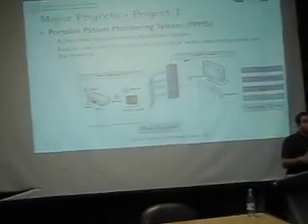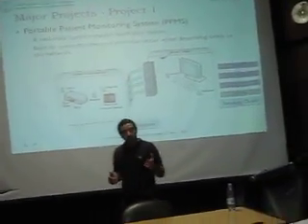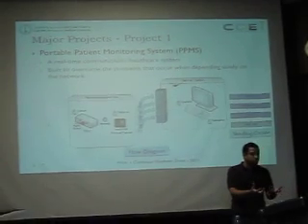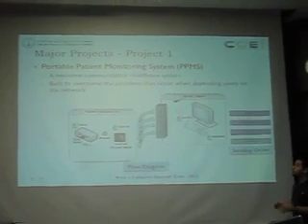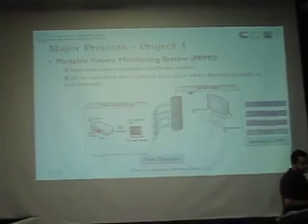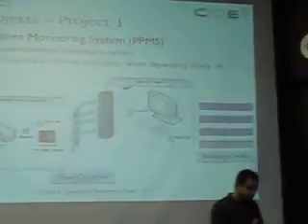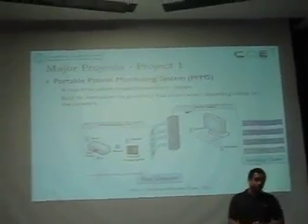So we want to depend on different communication standards so that whenever a network is having some failures, we don't want the monitoring data of our patients to be lost anywhere or to be cut off. So we used 4 communication standards to fulfill this objective. We used radio, 3G, WCDMA, UMTS, which is a 3G standard, GPRS, and the SMS of GSM, of course.